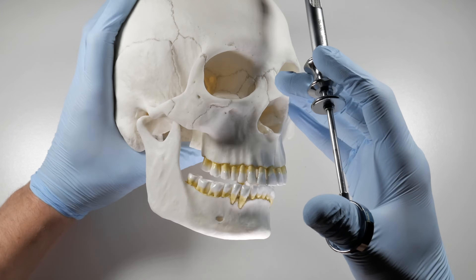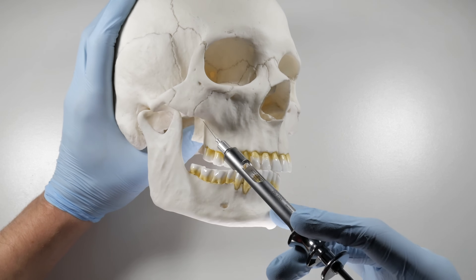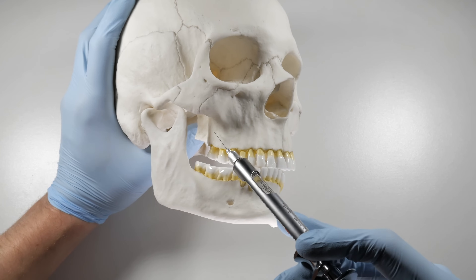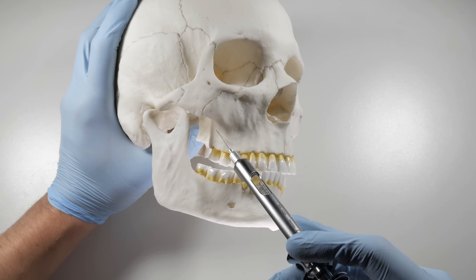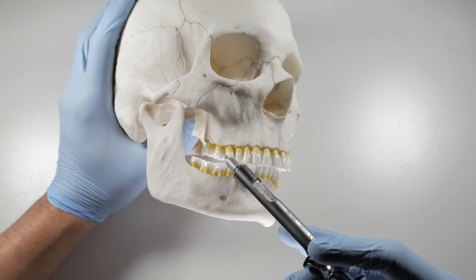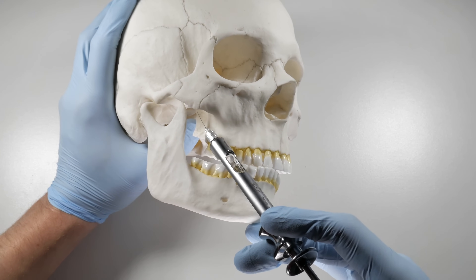The depth of your insertion is going to be about 16 millimeters. You will have no bony contact at this point. If you do, what's happening is you're inserting too medially and bumping into the tuberosity. So what you want to do is withdraw fully, reorient, and then insert again to your 16 millimeters.